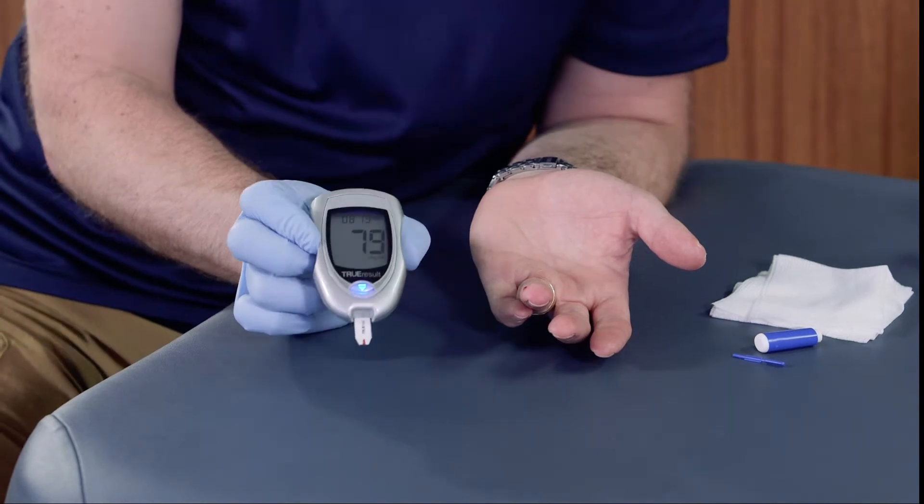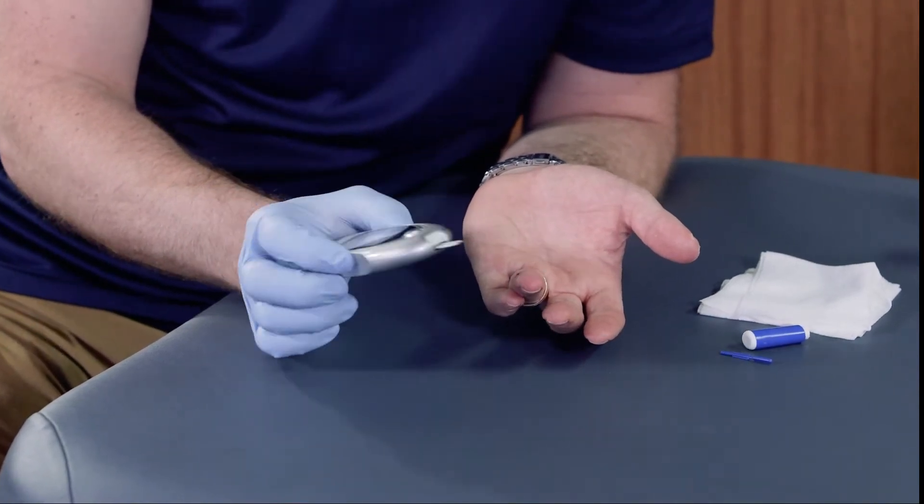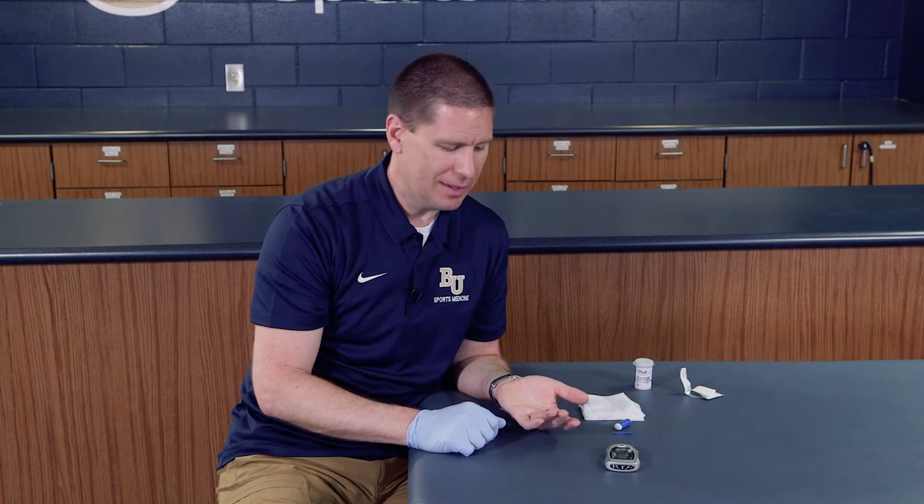It doesn't take too terribly long, and it's given me a reading of 79. At this time of day I have not had a lot to eat for the last four or five hours, so I'm reading a little bit low on blood sugar. A quick snack or some sugar would definitely elevate my blood glucose levels.